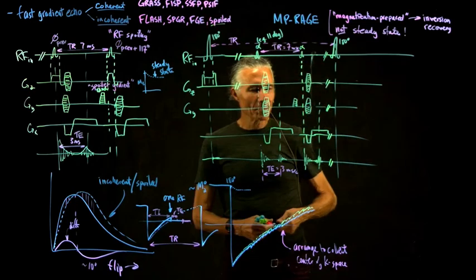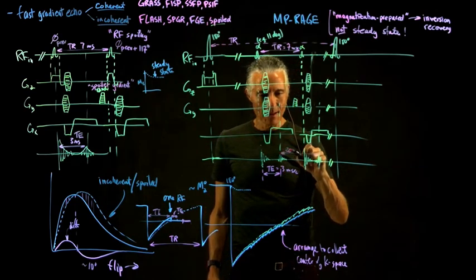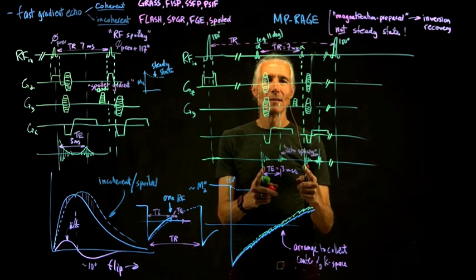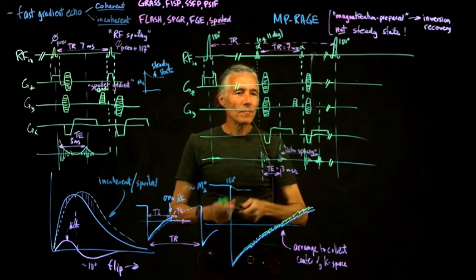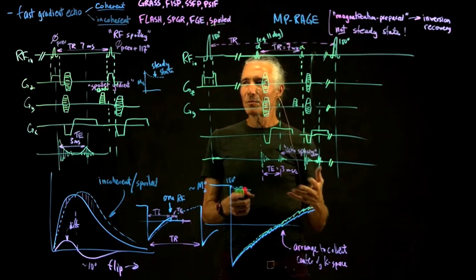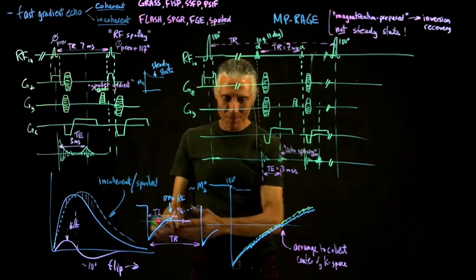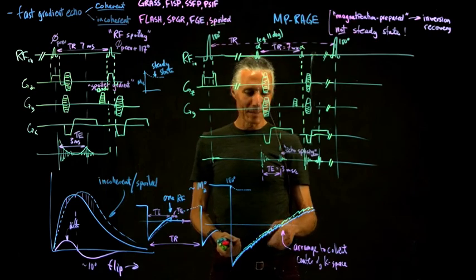So Siemens calls the TR echo spacing. If you look on the scanner interface, this is called echo spacing, which you can see is the same as this time here, the TR in between alpha pulses. So you'll have something like the TR listed as 2.3 seconds, which doesn't make sense for a fast gradient echo because it should be about 7 milliseconds. But it's just because it's a weird combination of inversion recovery essentially just for the center of K-space, but then recording all this additional data.